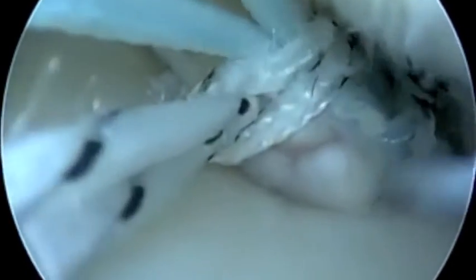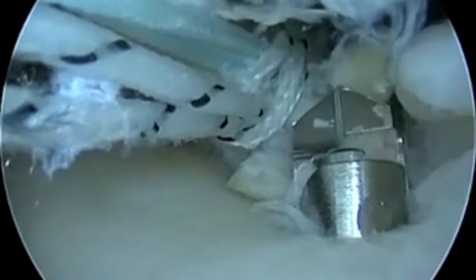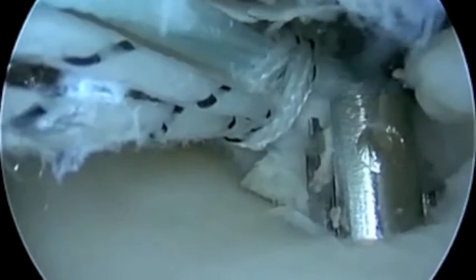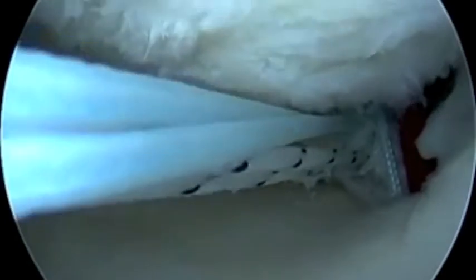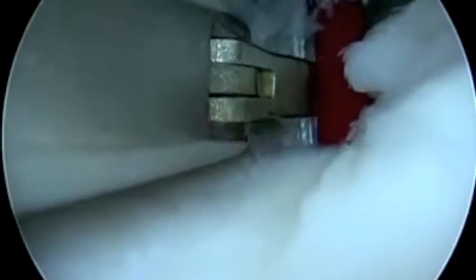We're assessing the integrity and we're going to drill retrograde. This creates a socket into which the meniscal root will be placed. Here's our passing suture — we're going to retrieve that retrograde.